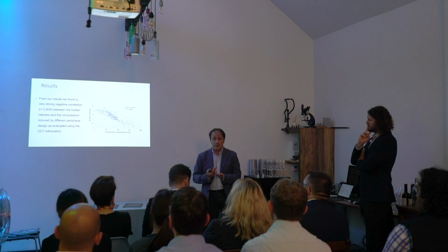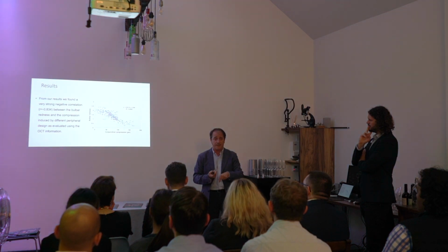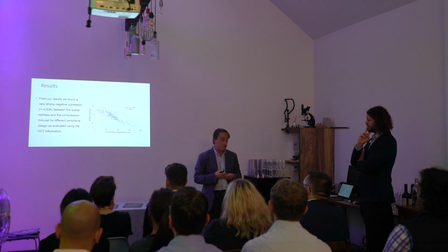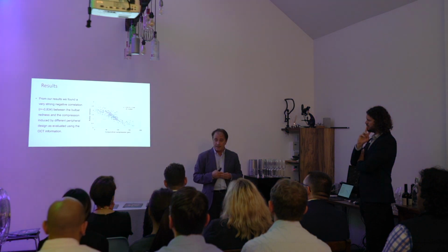Further studies are useful to understand the rebound effect. So, removing the lens, what happens on the anterior surface. But this is just a preliminary approach.